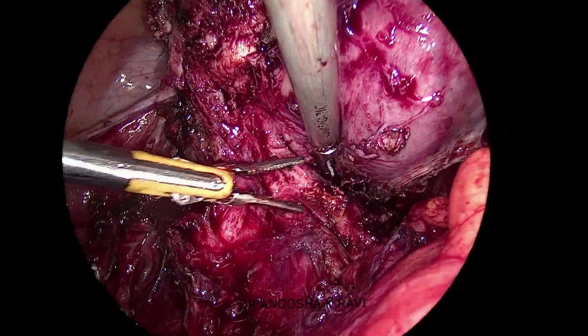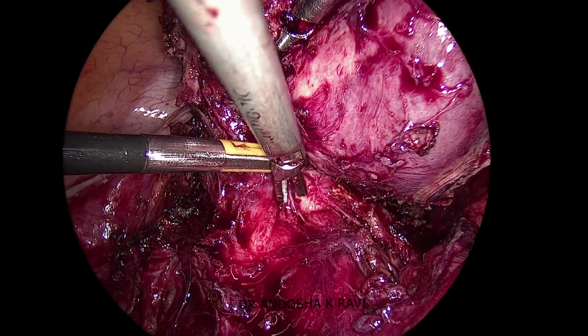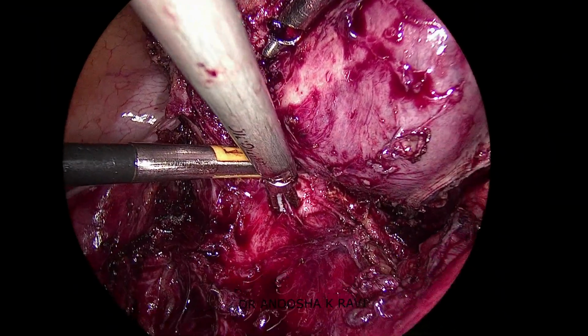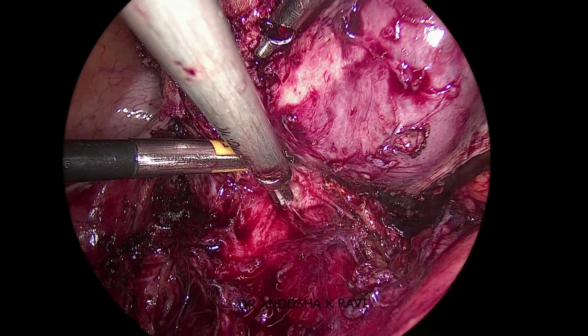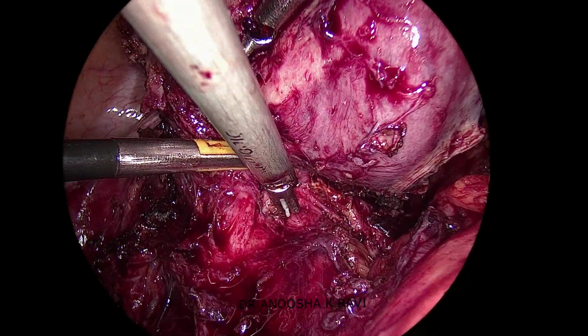In this step of rectal adhesiolysis, mostly sharp dissection is done to open the Denonvilliers fascia. Here we can appreciate rectal probing is being done. This is done intermittently to appreciate the margins of the rectum to safely dissect rectum from uterus.